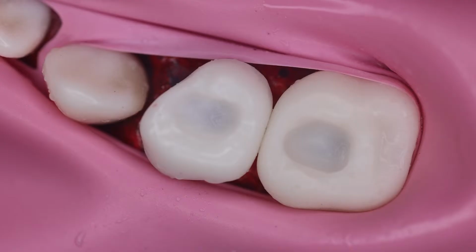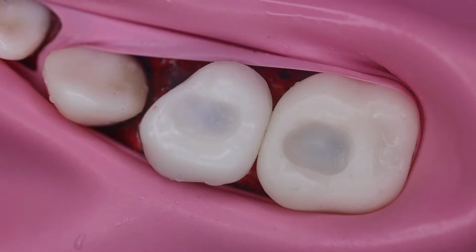Underneath you can observe that there is a shadow of the pulp. This is the roof of the pulp chamber. There is a darker area over here, so we need to restore it wisely. We are opting for a bioactive restorative, the Pulpdent Activa Kids bioactive restorative.